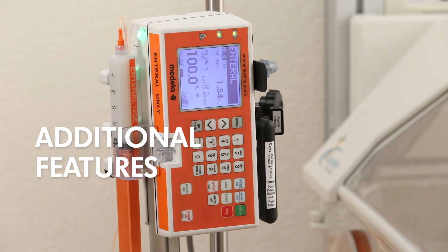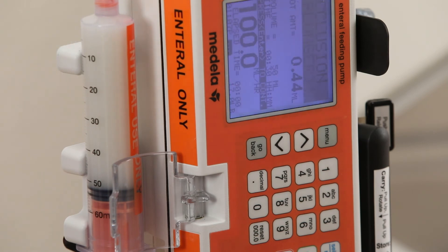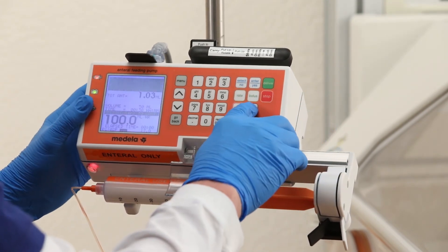The Medela Enteral Feeding Pump features occlusion detection, an alarm delay function, and will track total volume delivered even if the pump is turned off. When the Medela Enteral Feeding Pump detects an occlusion, it will draw slightly back on the plunger. In some cases, this eliminates the occlusion. If not, the pump will alarm to alert the clinician so the occlusion can be resolved.